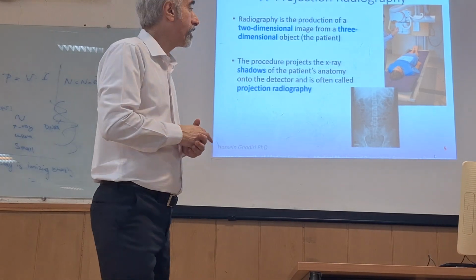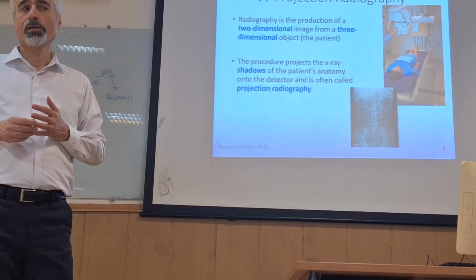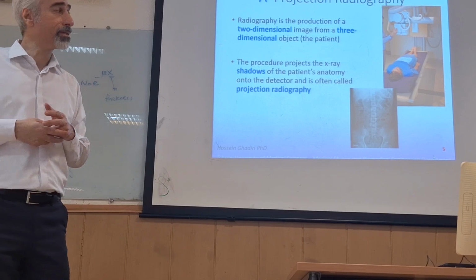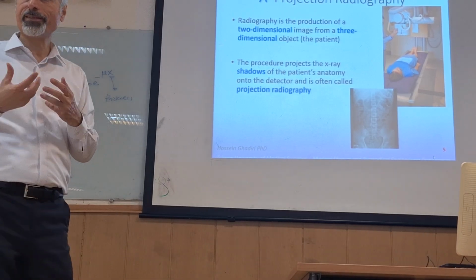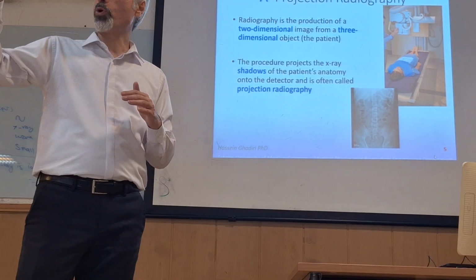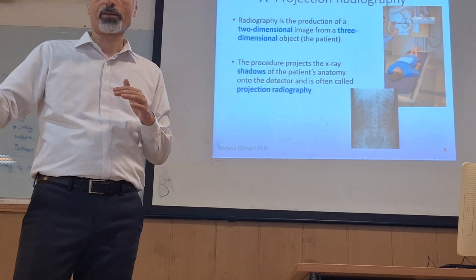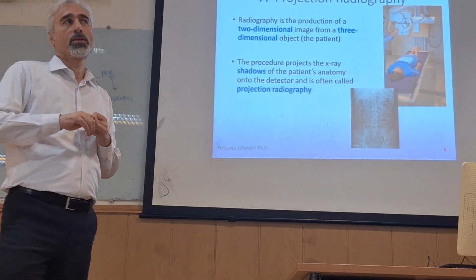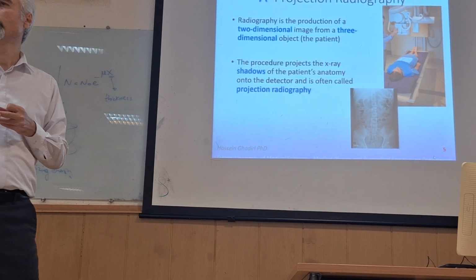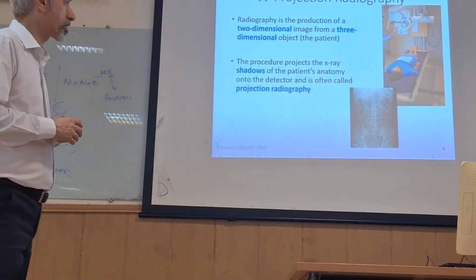But the main advantage is the imaging process is very fast, cheap in terms of the money patients should spend, and the X-ray radiation is low, for example, compared to more sophisticated machines like angiography and CT scan. So it's fast, low radiation, and in terms of payment, it's cheap compared to other machines.